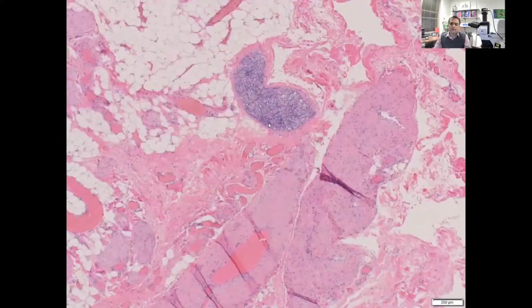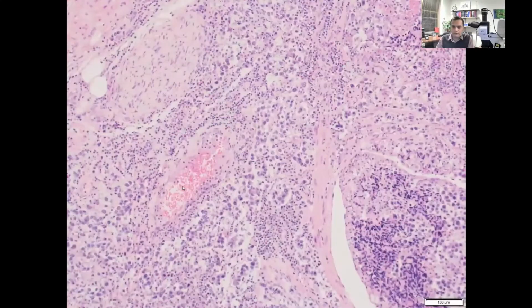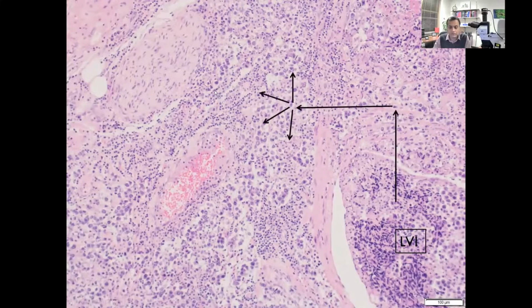So now we have another tumor over here, which is actually involving the spermatic cord as an LVI, right? So this is just LVI, and according to the current classification, we would just call it PT2, just as we saw LVI inside the testis itself. It would be the same. There could be a situation in which this LVI is so extensive. So here again, you see a section of the spermatic cord, and then here you see a vessel, and there is a thrombus, the tumor thrombus LVI, and this thrombus actually involves the wall of the vessel and actually gets out into the surrounding connective tissue.